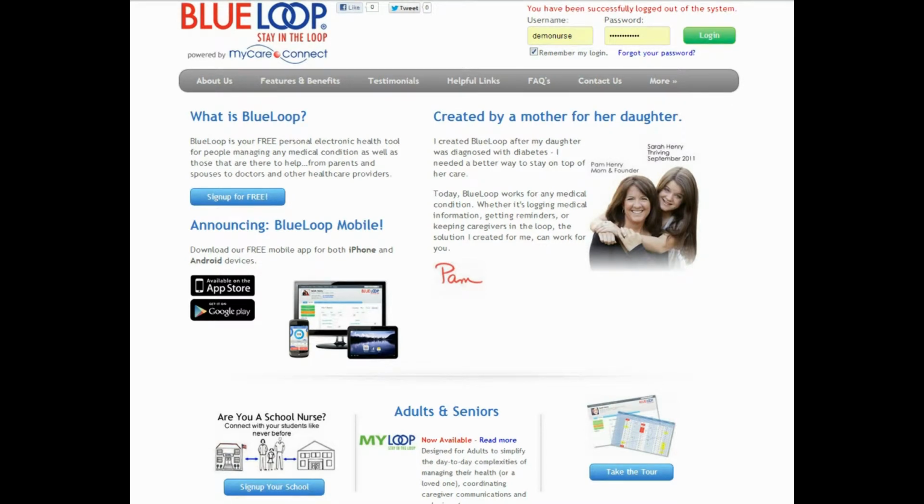Hi, my name is Pam Henry, and I'm the mom who created MyCareConnect BlueLoop. I created this tool as a way to better communicate with my school nurse.